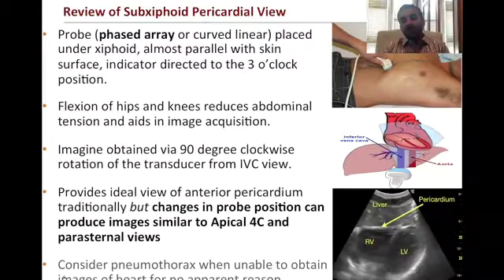Very important to also realize that if you see the liver and then you have complete dropout beyond that, the potential of pneumothorax does exist, and I encourage you to evaluate using the pulmonary point-of-care ultrasound exam techniques we've discussed to evaluate for the possibility of that.